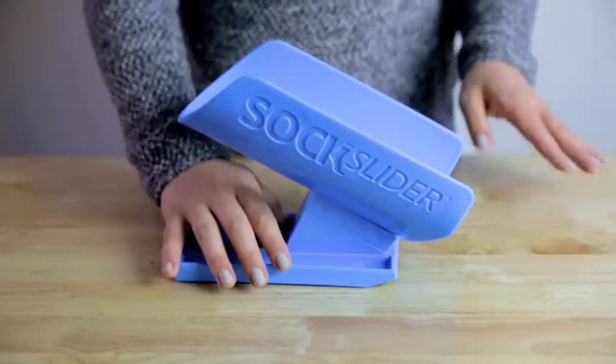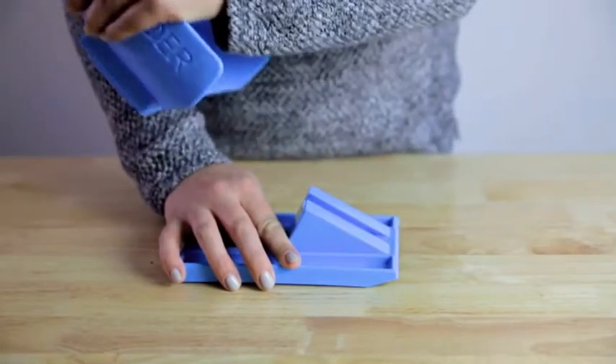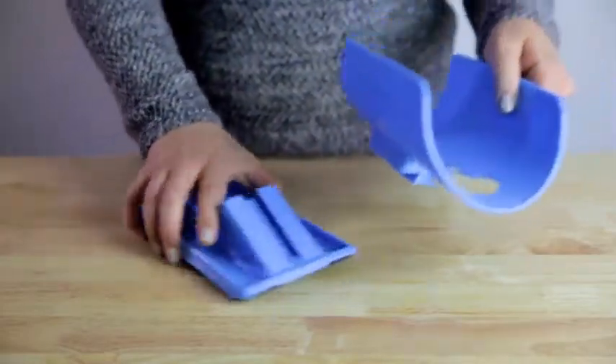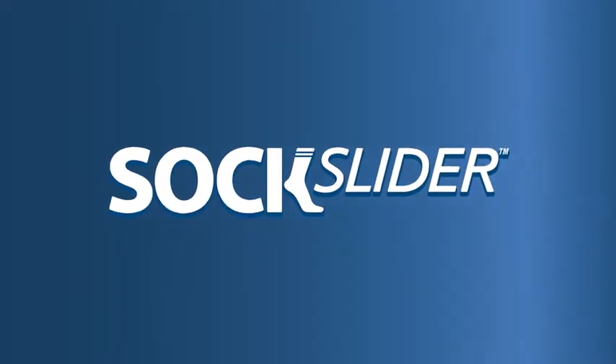To disassemble the sock cradle, firmly grasp the Sock Slider system base while pulling up on the sock cradle so the cradle detaches from the base. For more tips and tricks, please visit www.SockSliderTips.com.